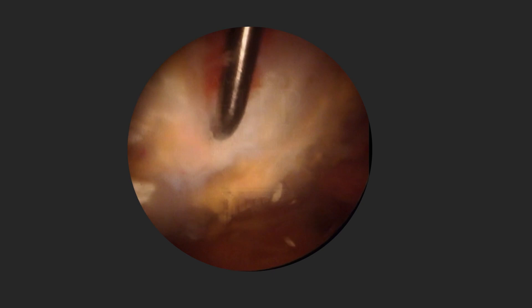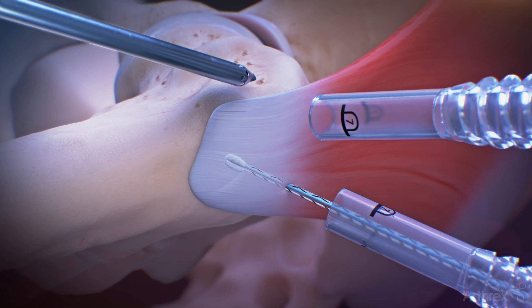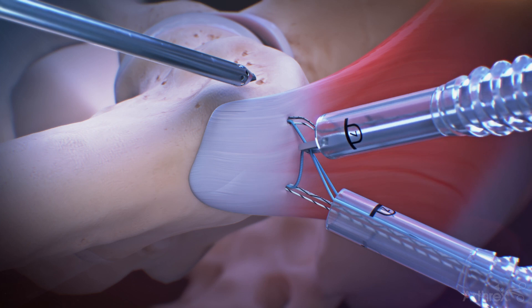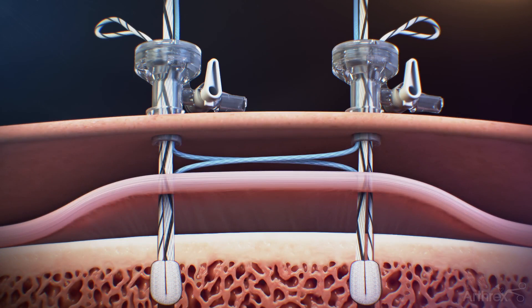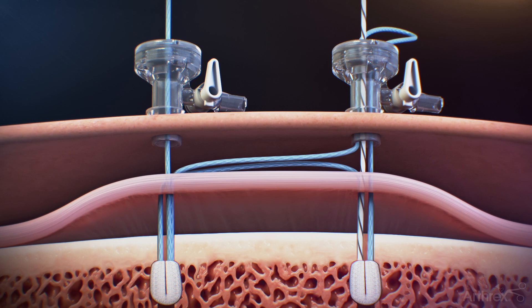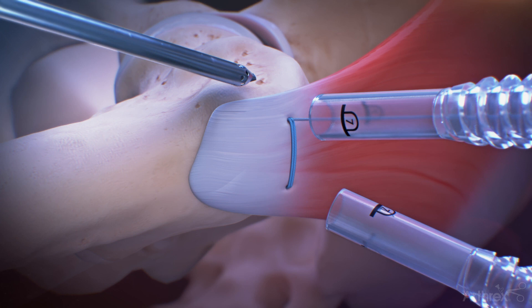We engaged in the tendon compression bridge technique for repair, starting with marrow stimulation using a microfracture awl or PIC. We then placed our knotless fiber tack anchors — the knotless 2.6 fiber tack anchors — in pairs. The pairs are linked to one another: A to B and B to A, creating the tendon compression bridge. As we pass the repair suture from A to B and from B to A and tension them, this seats the tendon compression bridge over top of the tendon, compressing it against the bone on which we have done a micropuncture for marrow stimulation. This can be done with one, two, or even three pairs of anchors creating multiple tendon compression bridges across the tendon.